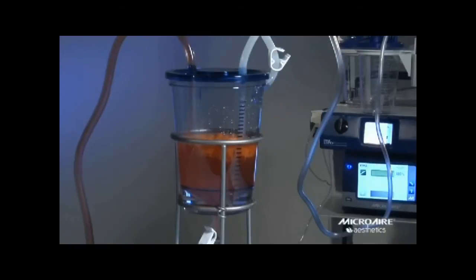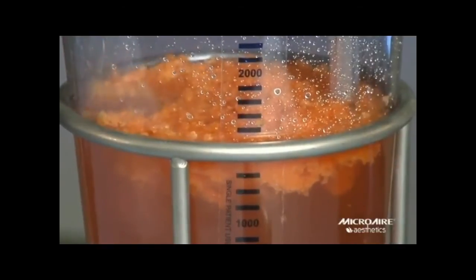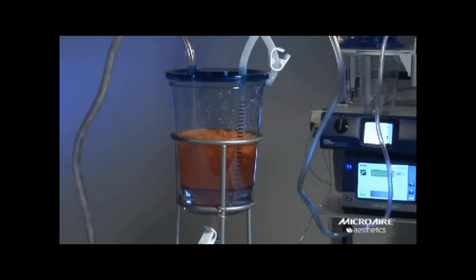As you harvest you will see that as soon as the fat enters the canister it begins to separate and is washed by the preloaded fluids. Live cells rise immediately and the washing separating process begins.